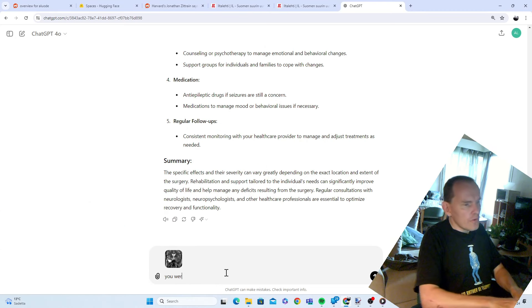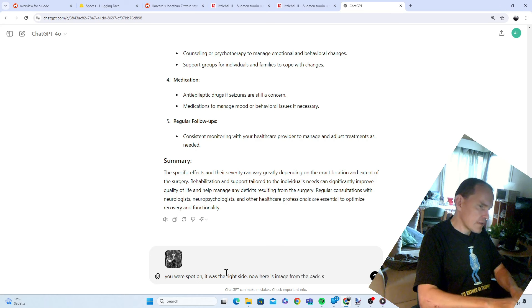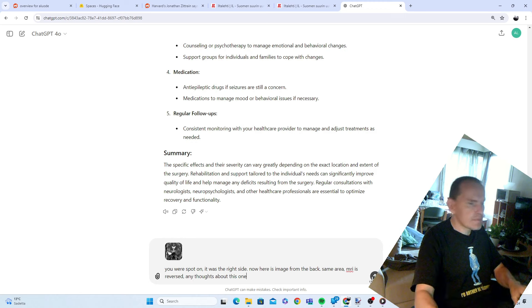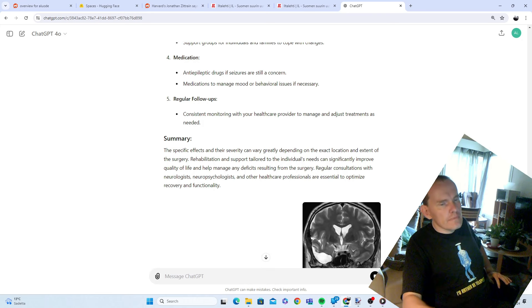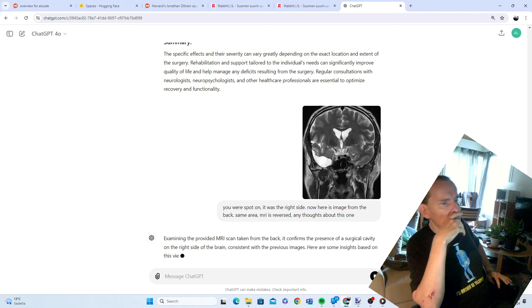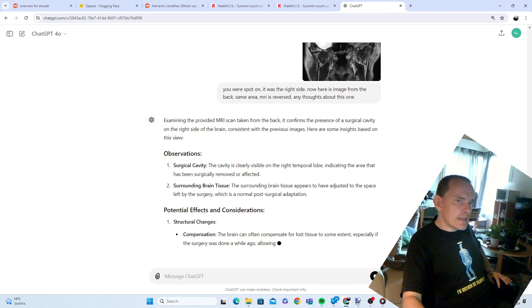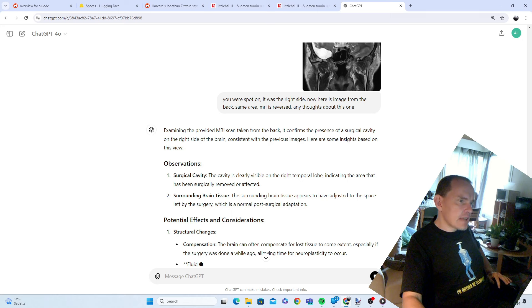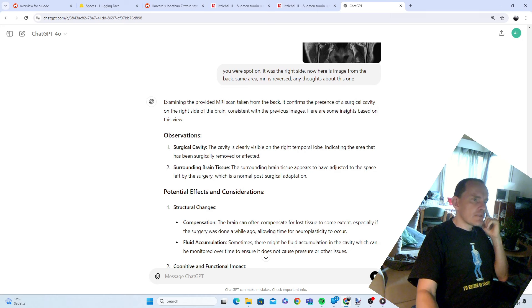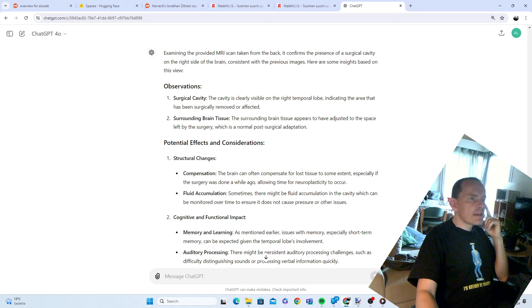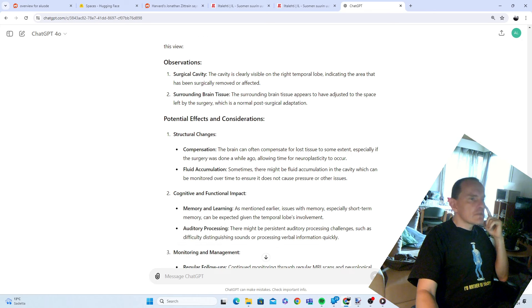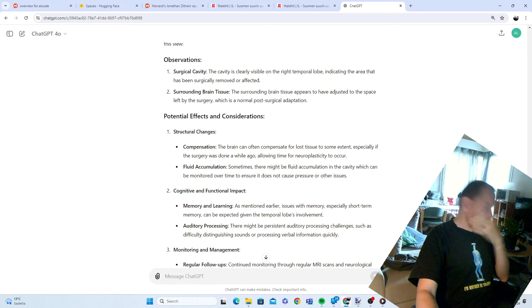You were spot on, it was the right side. Now here is an image from the back, same area. Examining the provided MRI scan taken from the back confirms the presence of a surgical cavity on the right side of the brain consistent with the previous image. The cavity is clearly visible on the right temporal lobe indicating the area that has been surgically removed or affected. The surrounding brain tissue appears to have adjusted to the space left by surgery, which is normal post-surgical adaptation. That's exactly what I was told, that there is sort of scar tissue.